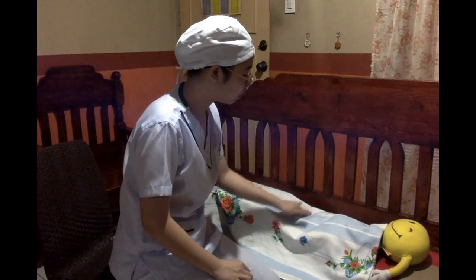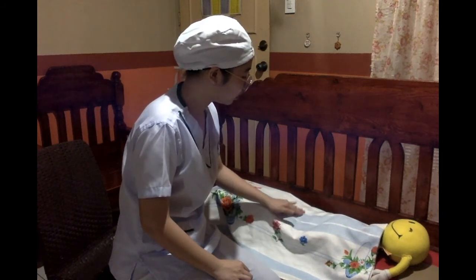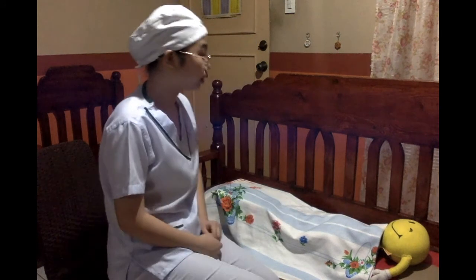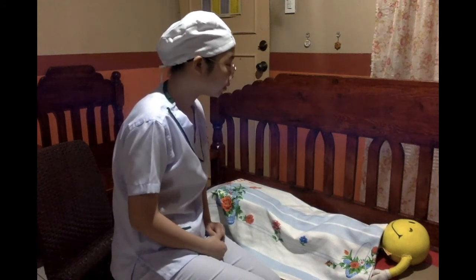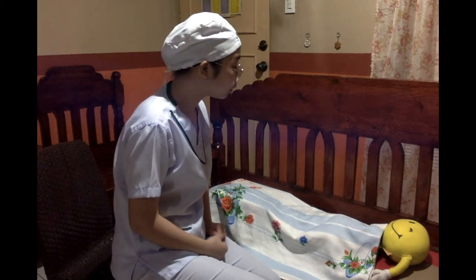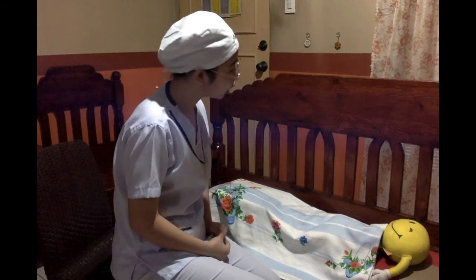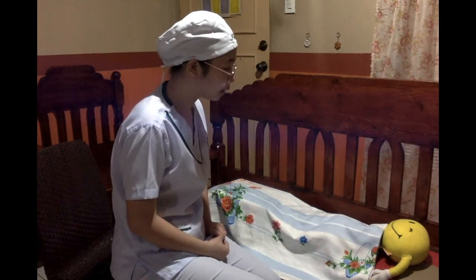Okay. Ayan, nakaumbok po. So, naaano ko po ngayon na puno po yung lugar kung nasaan po yung ihi ninyo. Yung catheter po ba o sonda po, narinig nyo na po ba? May ideya po ba kayo or naranasan nyo na po ba?